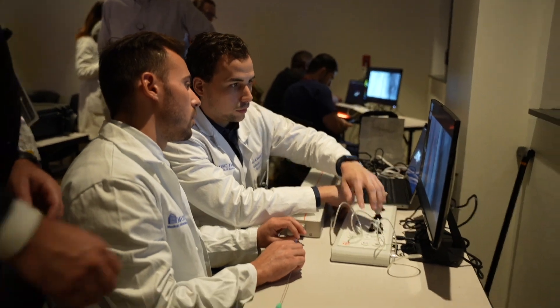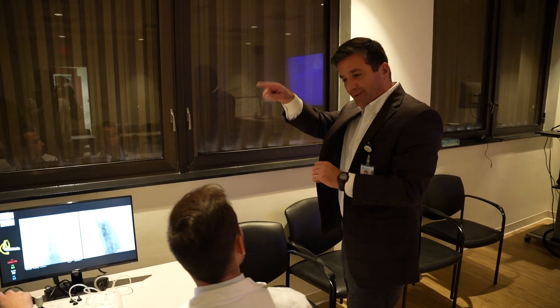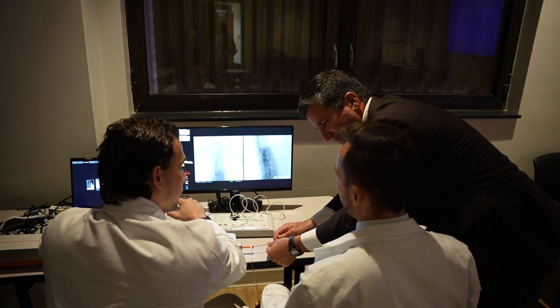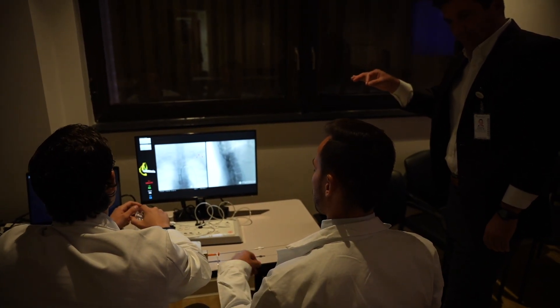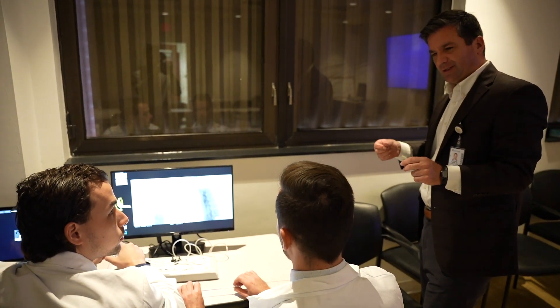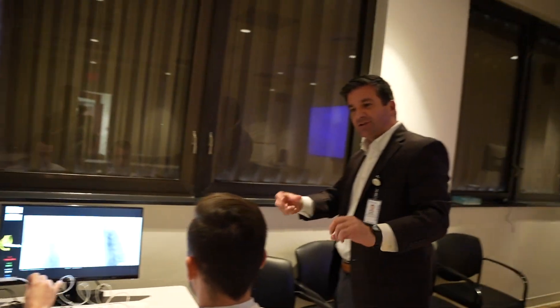Let me show you guys one thing real quick. Josh, these catheters are flexible. Look, guys — if you're only here, it can just be spinning on itself like a green branch and not travel. You want the spinning to be happening at your catheter tip. That's why you have one hand here rotating and one hand here, to make sure the spinning isn't just happening here but is actually being transmitted to the part in the patient's body. So if you're turning up here, why do you have to turn back here? Because the catheter is more flexible than you realize. If you do it in one place, it'll just twist on itself. When you do it in two positions, you're actually transmitting it. Thank you.